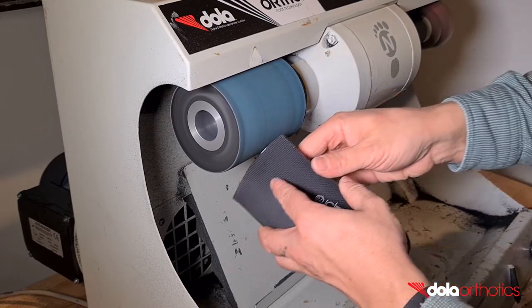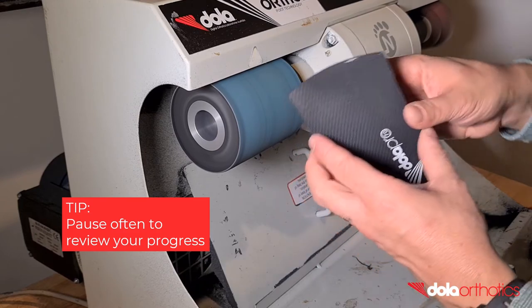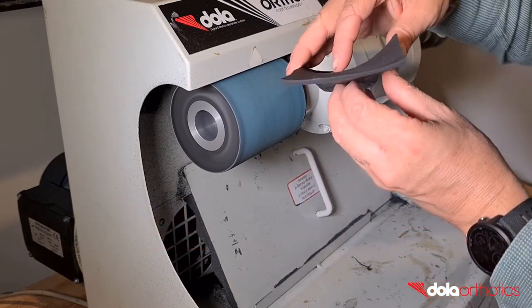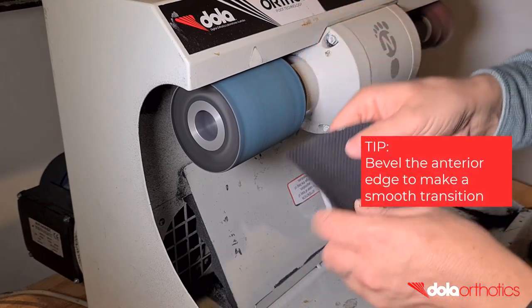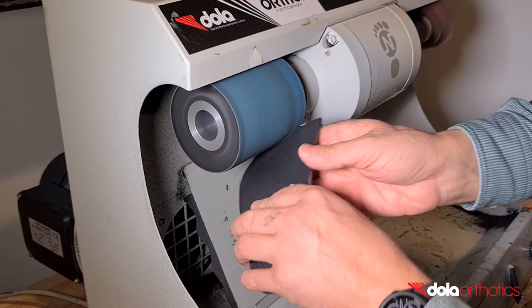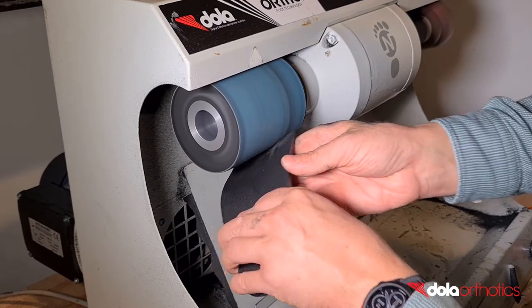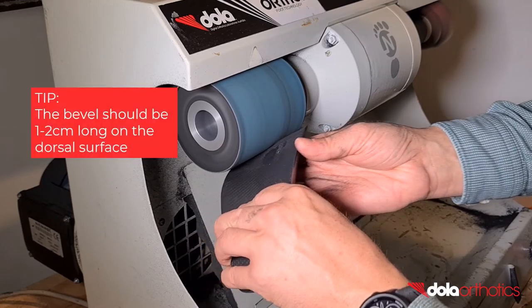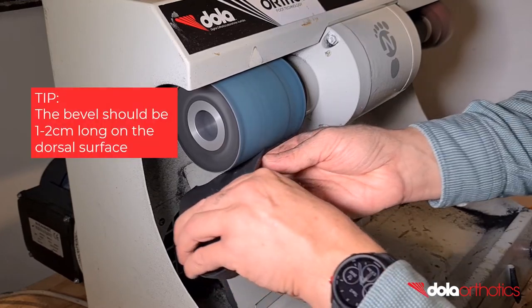Change your hand position to hold the dorsal and plantar surfaces of the orthotic. This position allows you to taper the anterior edge of the orthotic to blend the thickness or lip. Start with a 45-degree bevel from the top surface and then increase this angle to connect the top and bottom surfaces. This bevel should be 1-2cm long on the top surface, making the transition smooth and comfortable for the patient.